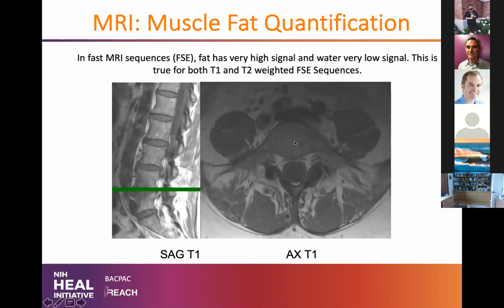And that's because muscle has very short T2 properties and very long T1 recovery times. That means the muscle is always relatively dark in T2 and T1 weighted images. The reason we pick T1 weighted images to look at the muscle is because most of the time the T2 weighted sequences are fat suppressed, because the clinicians want to see other things than muscles.